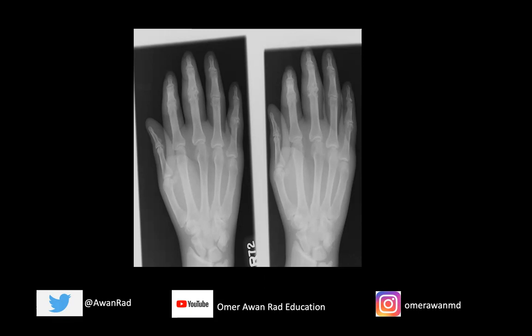We have a frontal view of bilateral hands. Looking at the hands here, I want to point your attention to the third PIP joints bilaterally. The finding that we're seeing here are erosions — we're seeing loss of bone centered at the third PIP joints bilaterally.